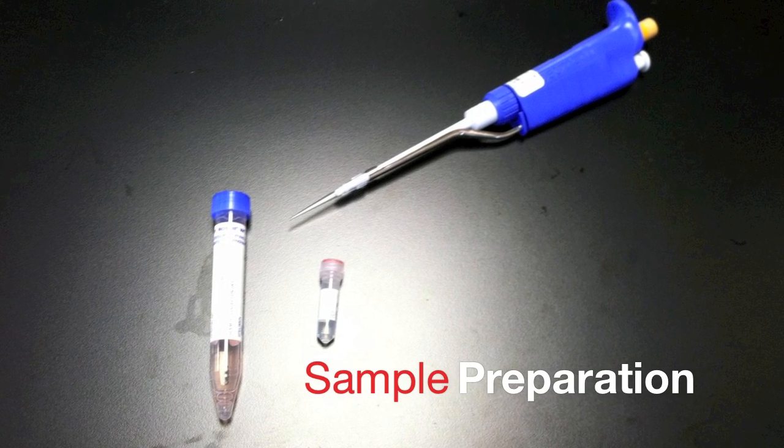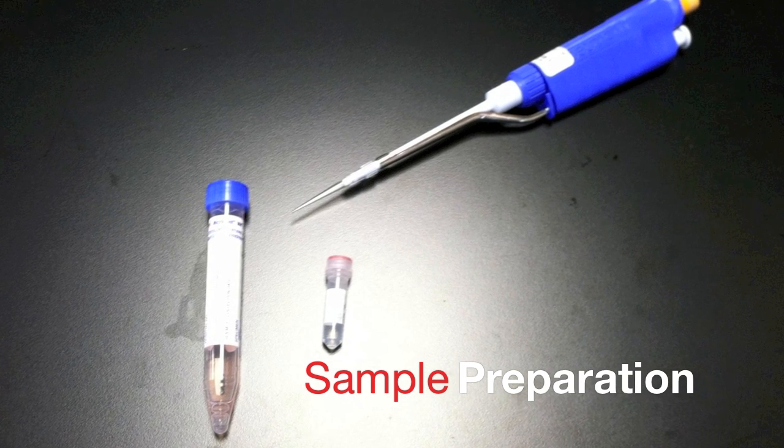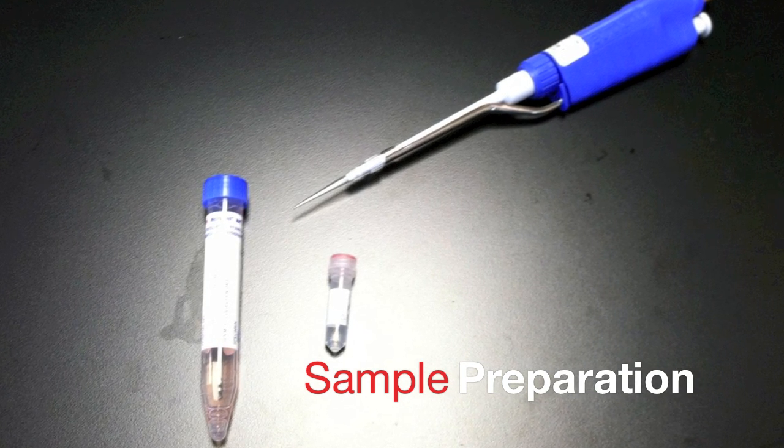Sample prep consists of a simple one-step dilution in which specimens in viral transport medium are diluted 40-fold in dilution buffer.